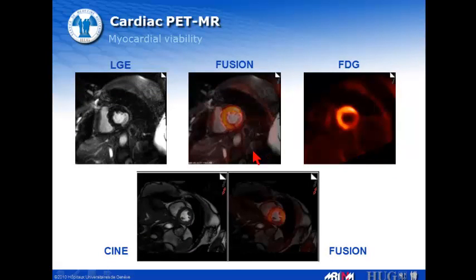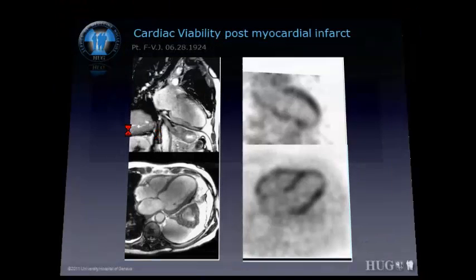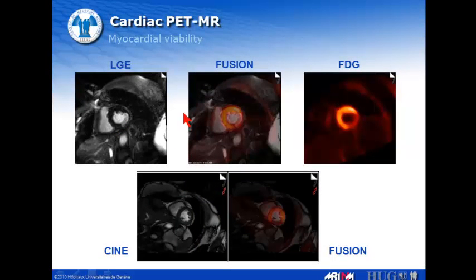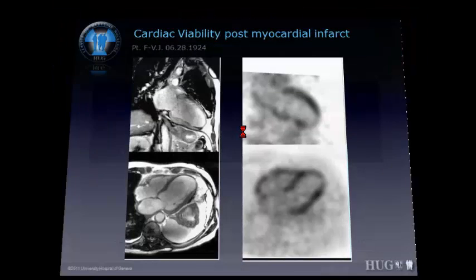However, another patient, also with late enhancement on MR, then fused with the PET using FDG. Here's almost a match finding. However, there is still some very, very low viability in this virtually infarcted region in PET.